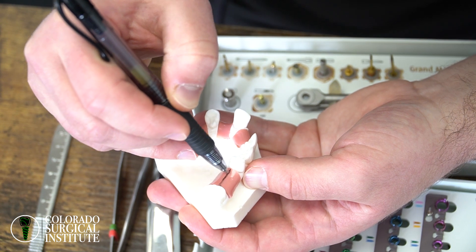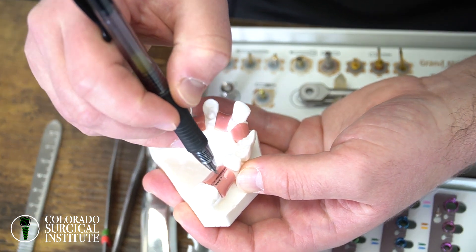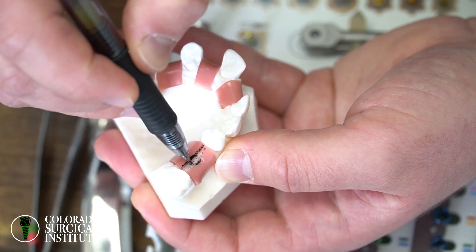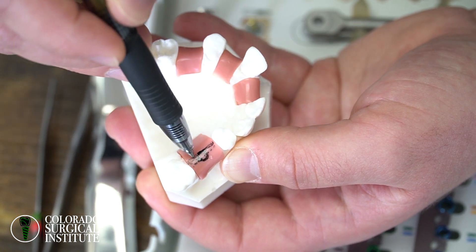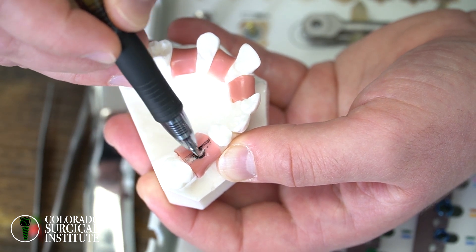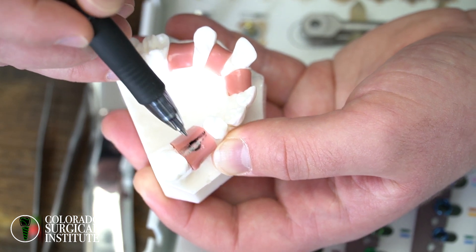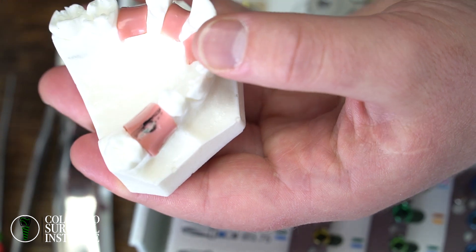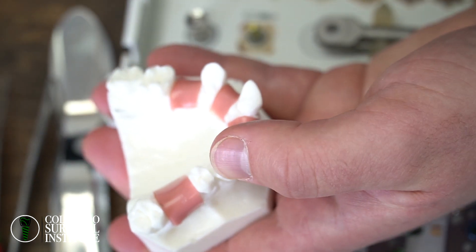What I'll show you is where we actually want the incision to be — you want it lingualized, right here, versus the mid-crestal position. When you put your implant right in the center of the ridge, the incision is on the back side. When you close this flap, if it opens a touch, it's going to be on the back side of the implant, not directly over the top of it. That drastically decreases the risk of peri-implantitis or infection causing one to two millimeters of bone loss right from the start.